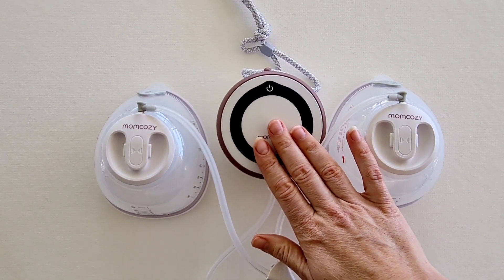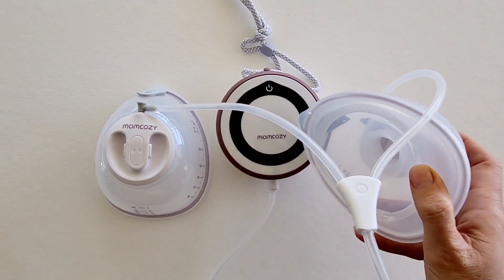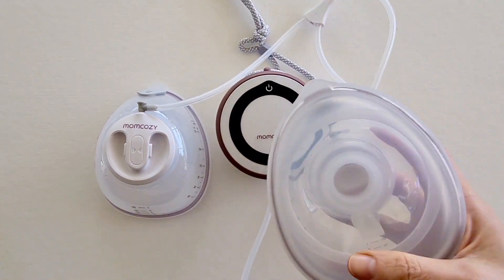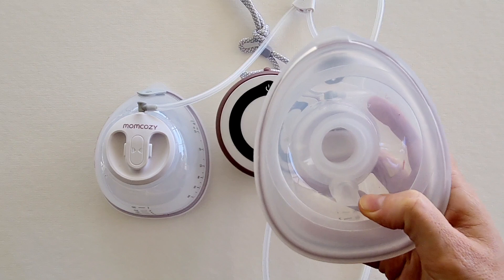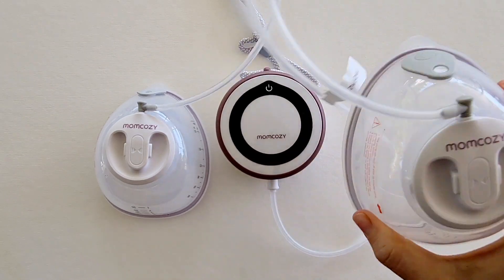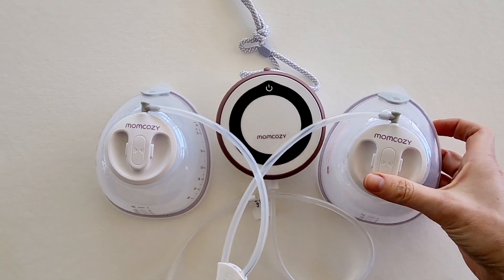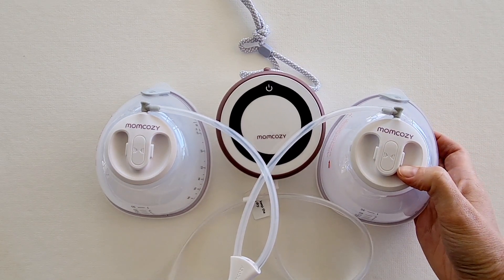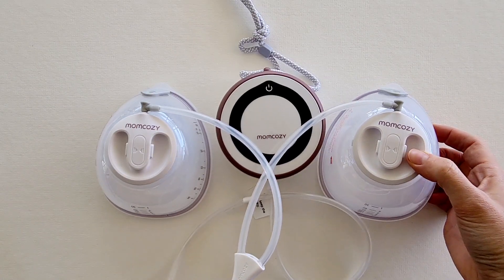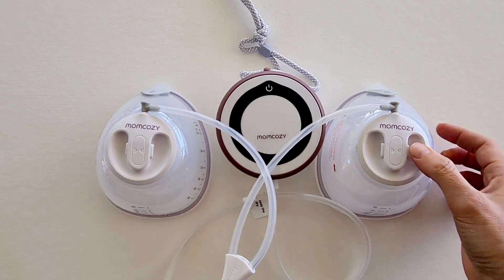It is also hand wash only for all the silicone parts — most Mum Cozy pumps are hand wash, as it's a really super soft silicone that may be more delicate in the dishwasher. There are also no advanced features such as Bluetooth or a tracking app, but for the price and for a wearable pump, the micro vibration technology really is an advanced feature that you don't get on a lot of other pumps.